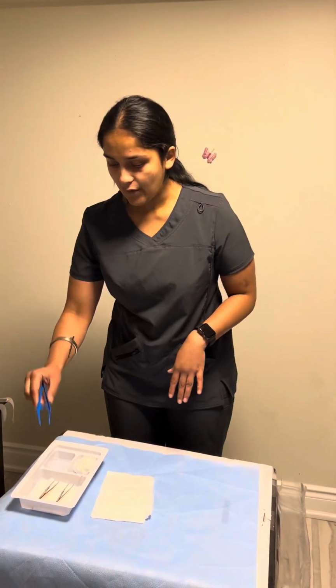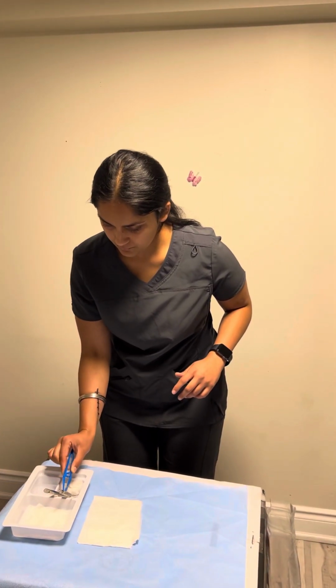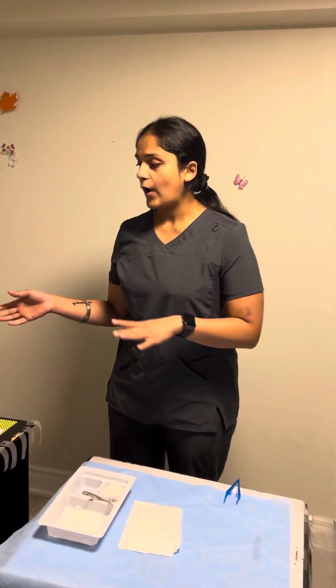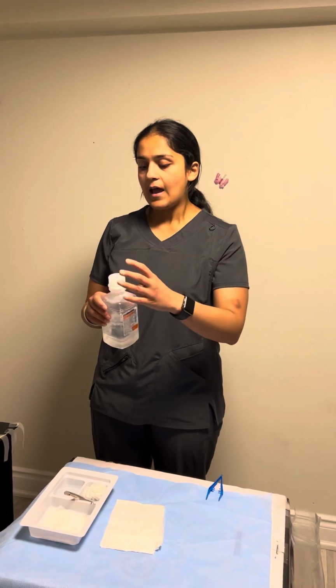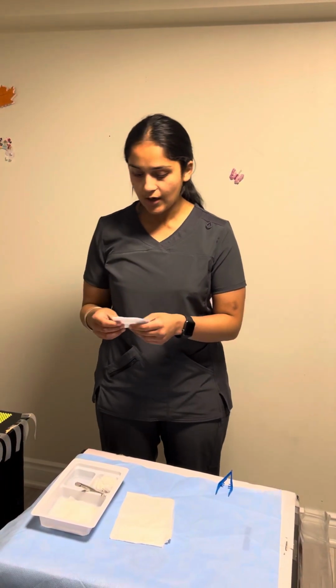In the tray I have 4x4 gauze pieces, 2x2 gauze pieces, and 2 forceps. I'm going to put the forceps within the 1 inch border to maintain the sterility of the equipment. Now I'm going to add normal saline to clean the wound of the patient, and I'm going to pour it from the top. This is the new opening, and I already documented the date and time of opening of the normal saline. Now I'm going to add some extra gauze, and I'm going to open and pour it in the tray with the help of the banana peel method.